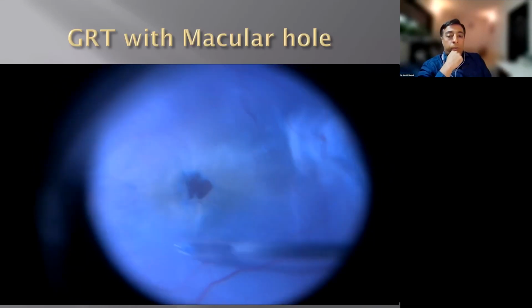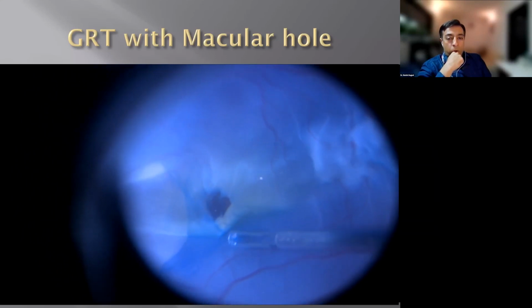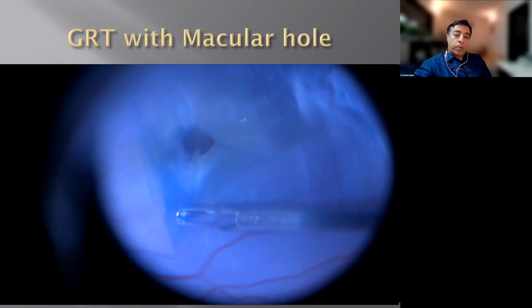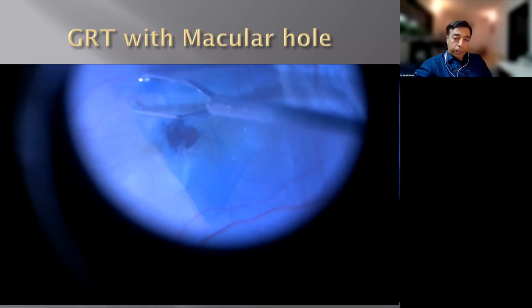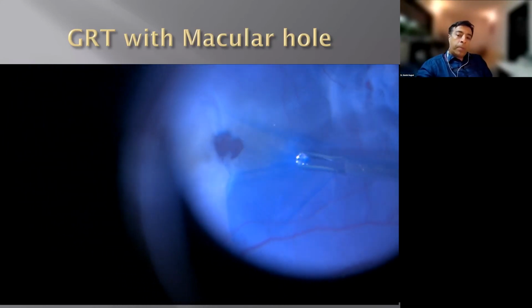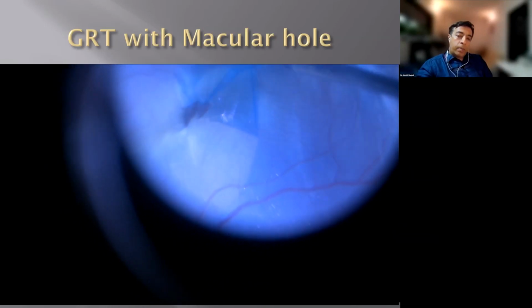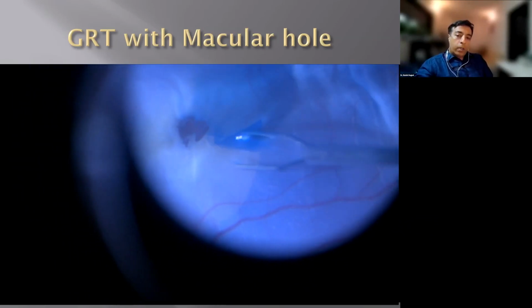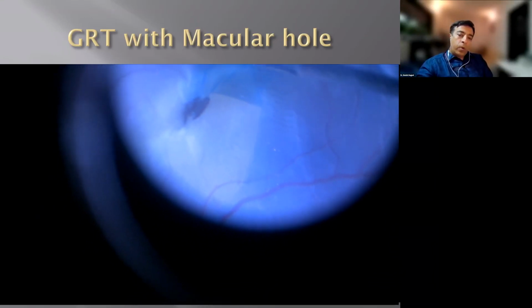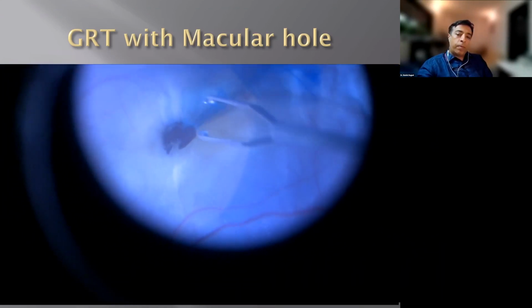After that, you can see that we are removing the ILM, the ragged edges of the hole are seen. We remove the ILM, and in this case, the ILM is removed up to the edge of the peripheral tear actually, because there's so much contraction in the retina between the hole and the peripheral tear that we feel that with the ILM peeling extended temporally, that whole segment of retina would get relaxed. So here you can see that the ILM is being removed around the hole, and then we extend it to the periphery.